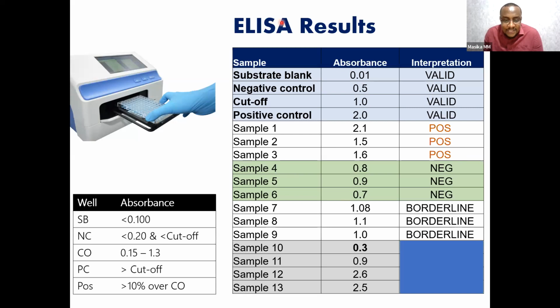Retest. Ria Patel, you are right. You retest, you repeat. Or you can even test with a different assay. And you can see there's another batch here that is false negative. Maybe the question here is what happened, because it is too low. If the sample is too low, maybe you didn't add your sample into the well. You thought you added, but you didn't. So there could be issues.